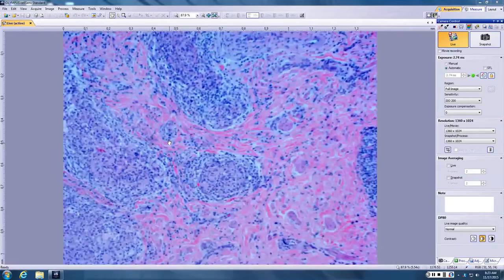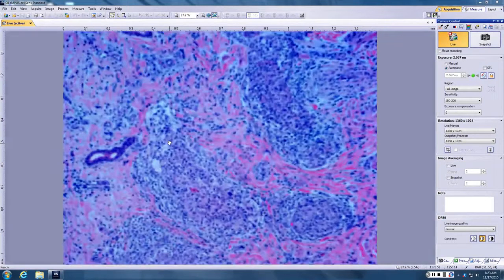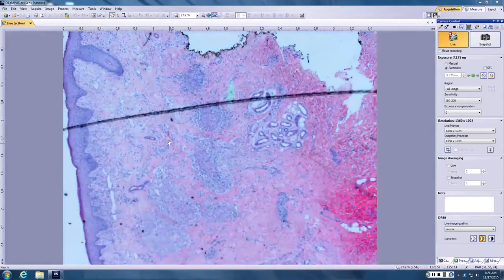So, Katie, what do you see here? Looks granulomatous to me around the vessels. So it looks granulomatous, and you said around the vessels. If you have granulomas that are horizontally oriented, parallel to the surface, and follow the neurovascular bundle, what are you thinking? What are you describing? I mean, you have to rule out leprosy.